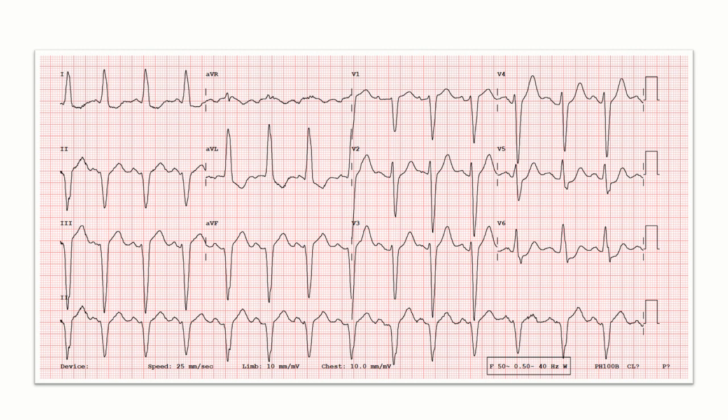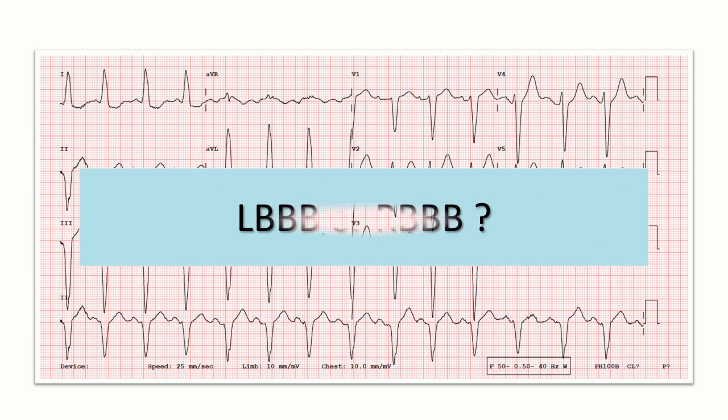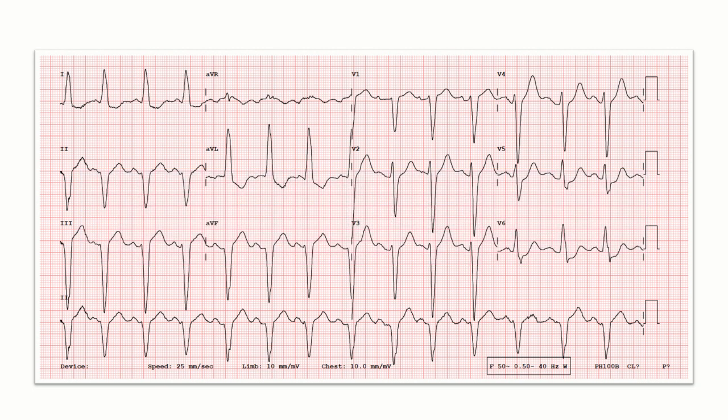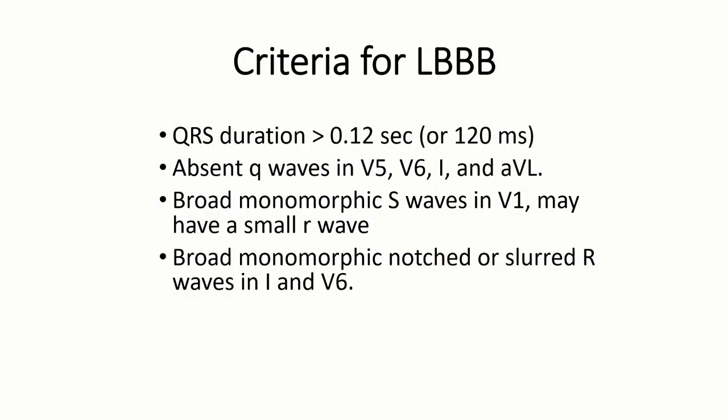This ECG is not normal. We'll try to find out whether this patient has left bundle branch block or right bundle branch block. First of all we'll understand the criteria for left bundle branch block, then we'll try to apply these criteria in our ECG. First, the duration of QRS complex should be more than 120 milliseconds.